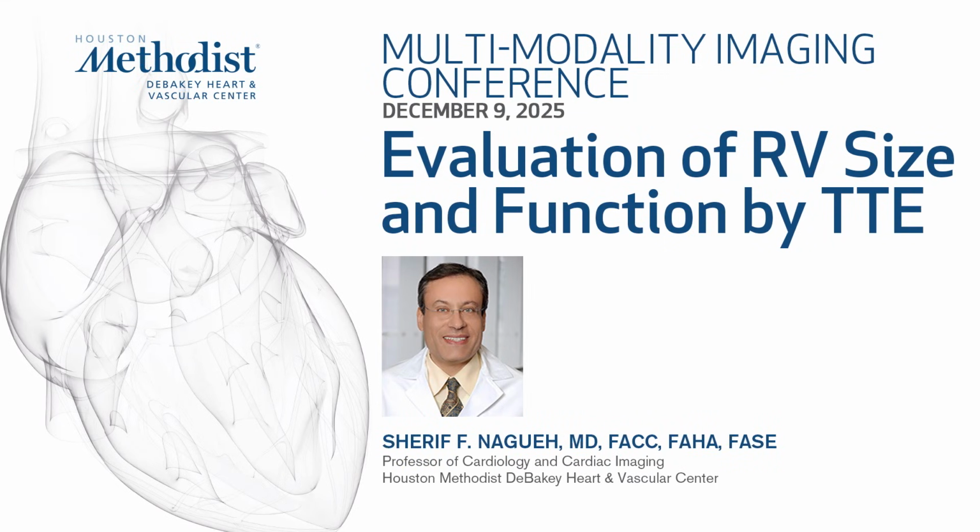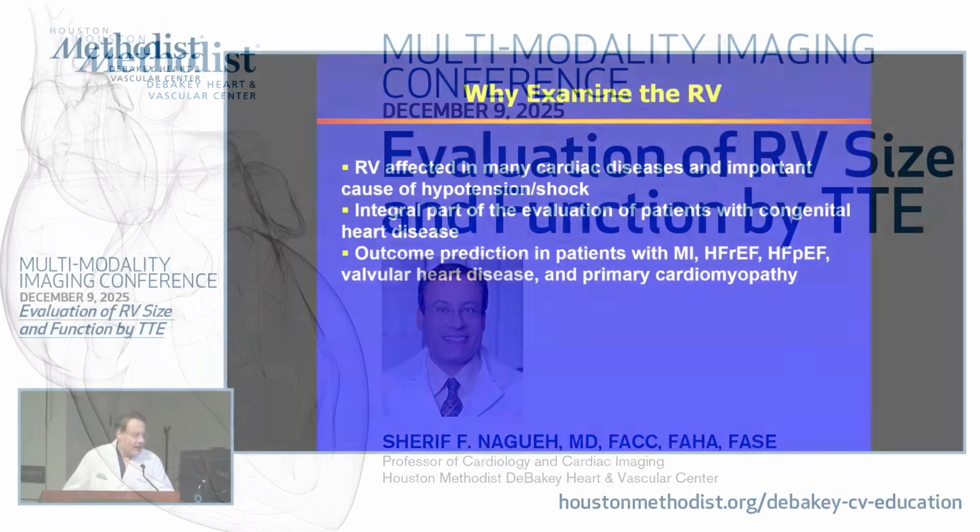Good afternoon. Today we'll talk about the assessment of RV size and function, RA size and function, and PA pressures. And I'm going to start now.